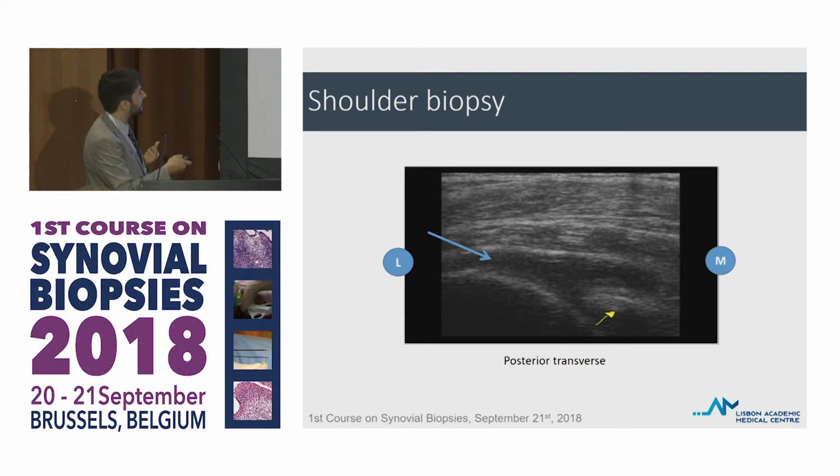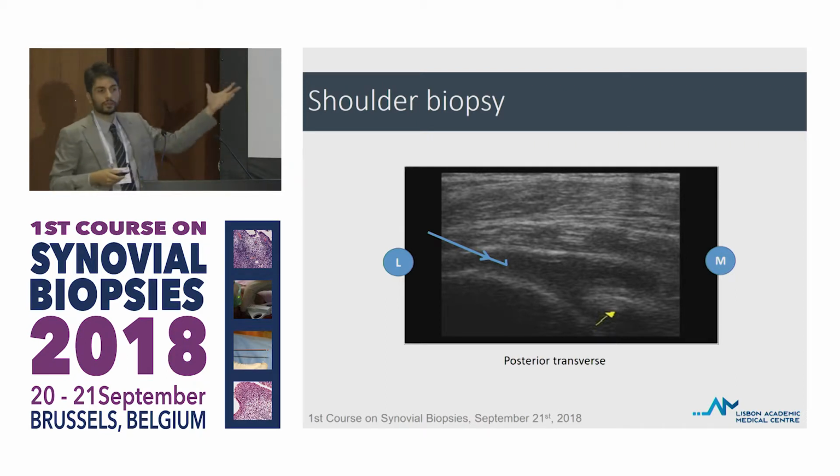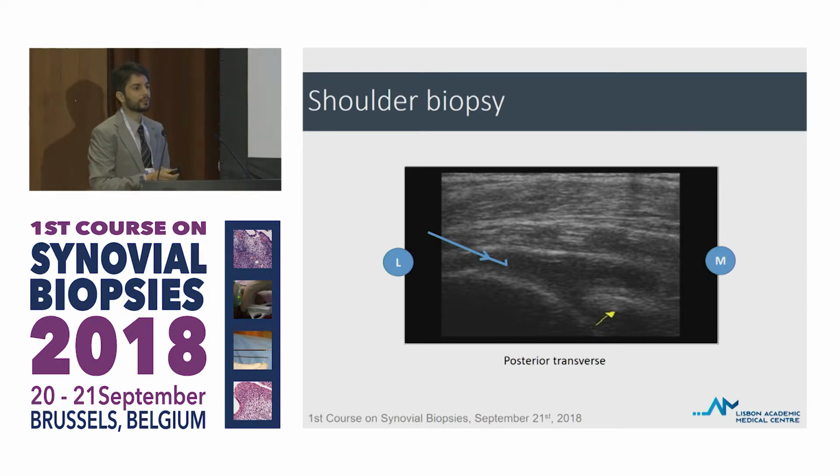So this is lateral, the needle comes from laterally to here, we open the throw, then we push, and we can do it this way. It's not very handy because we have to do it in this position, of course, but it is possible to do also. And it is easy to anesthetize. Of course, when we are talking about big joints, such as the shoulder, we have to inject a considerable amount of lidocaine inside the joint, about 10 to 15 milliliters at least, usually, okay? As Laurent already said before.